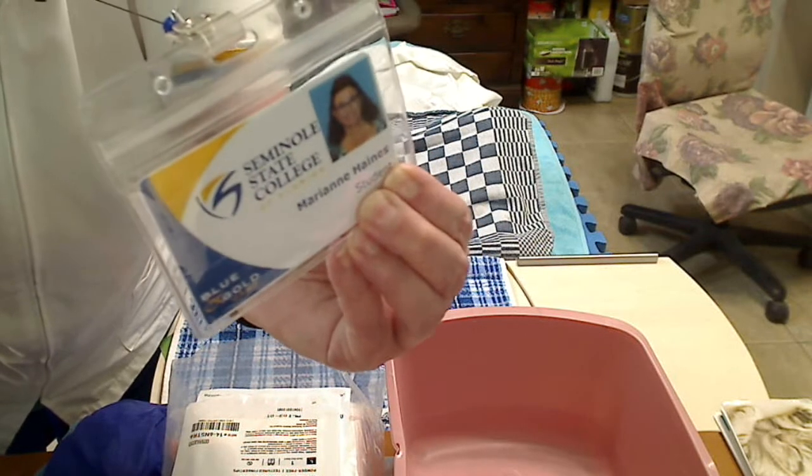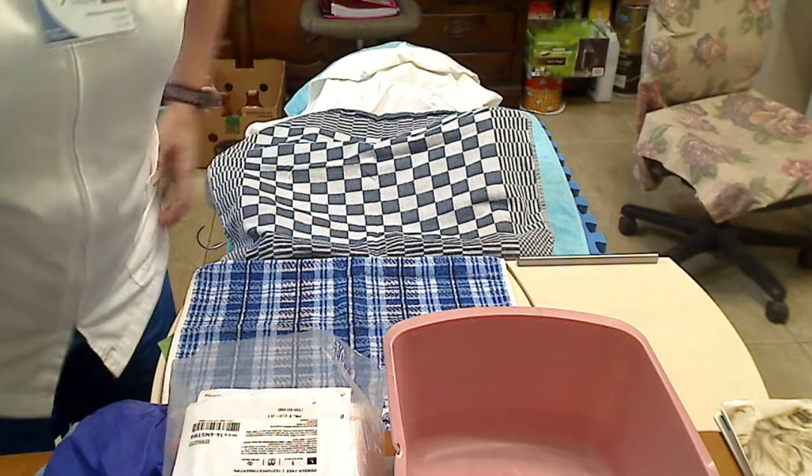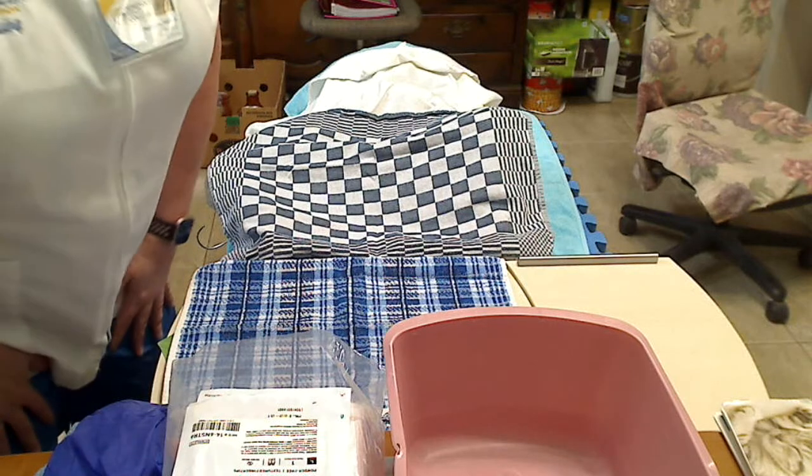Hi, my name is Mary Ann. I am going to be demonstrating how to insert an indwelling Foley catheter.